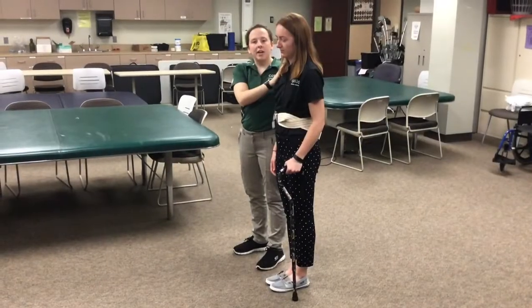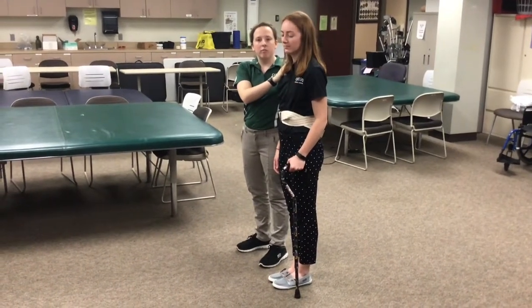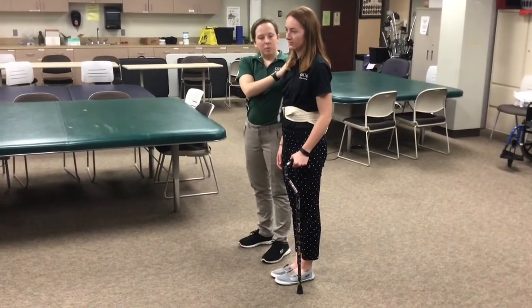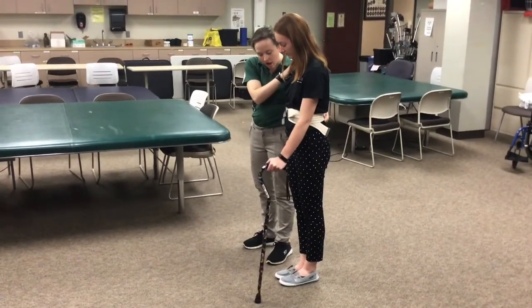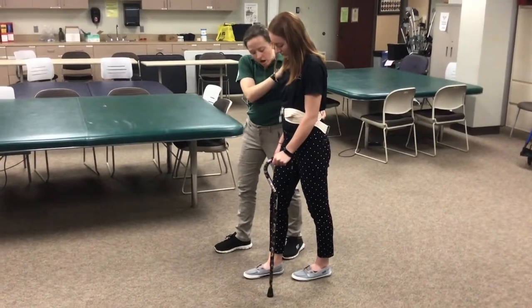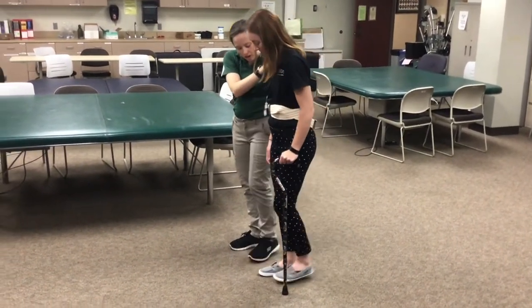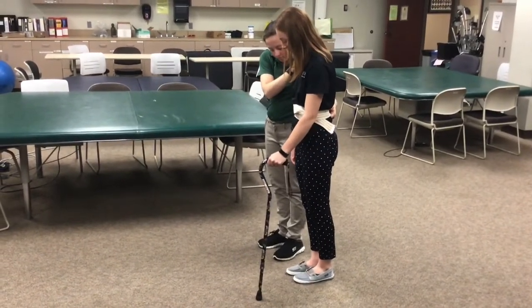You will begin by standing in stride with your patient with a hand on their shoulder and a supinated grip on their gait belt. First, your patient will move the cane forward one stride length, so can you move your cane forward, and then step with your involved extremity to meet the cane, and then you'll step with your uninvolved extremity. And then you'll continue that process.